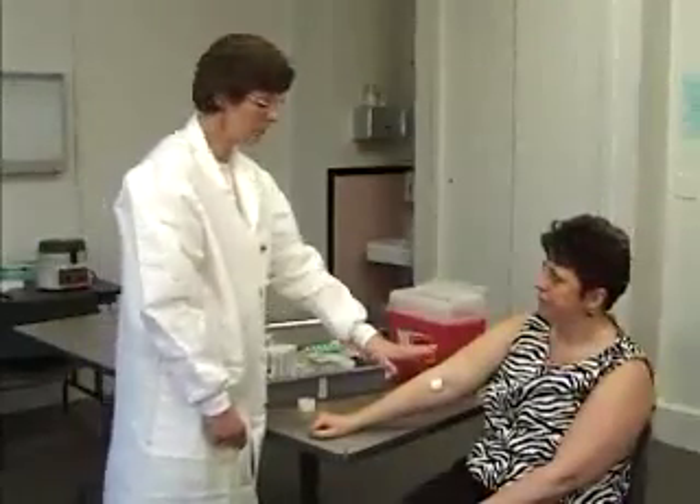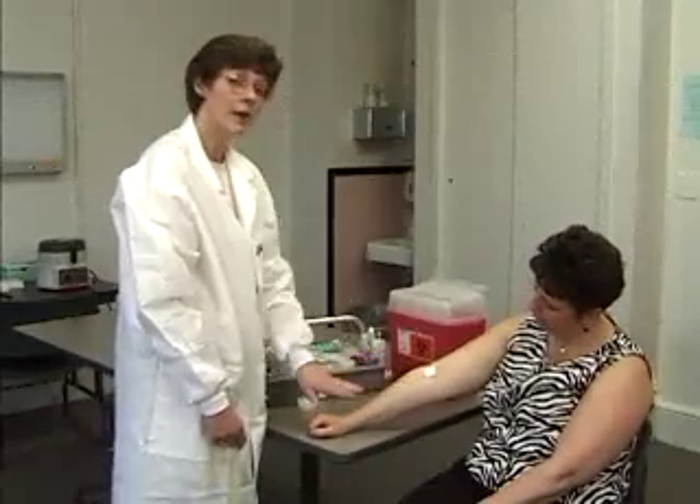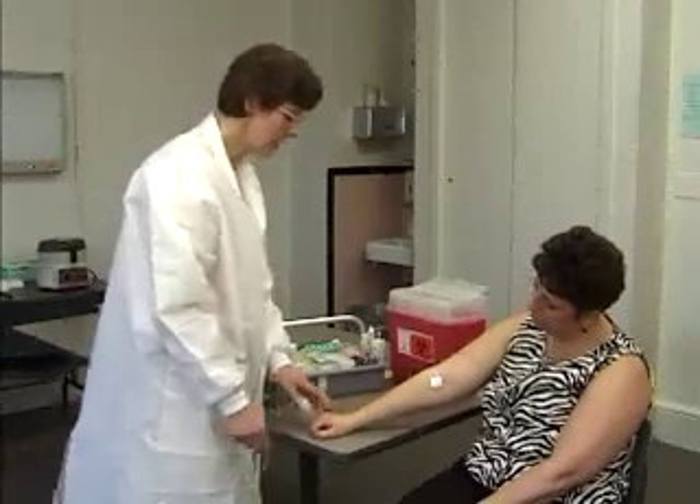If a patient — you can't get their blood in the antecubital area, or if for some reason they have an IV, you're going to have to go below the IV. So the next choice would be the back of the hand.